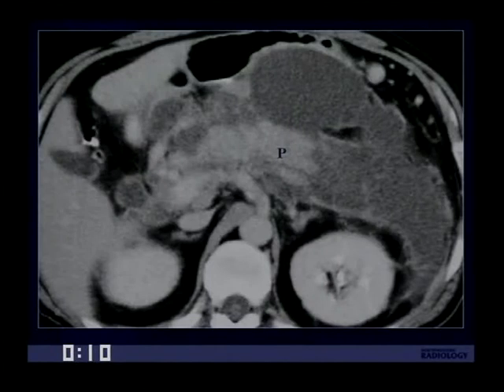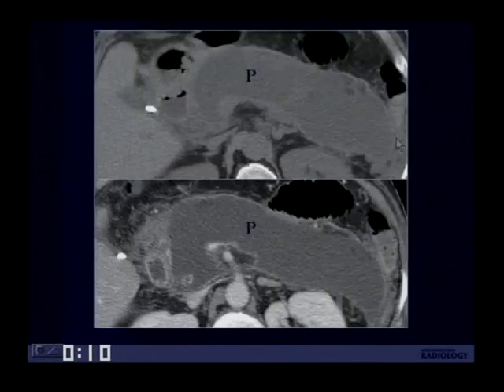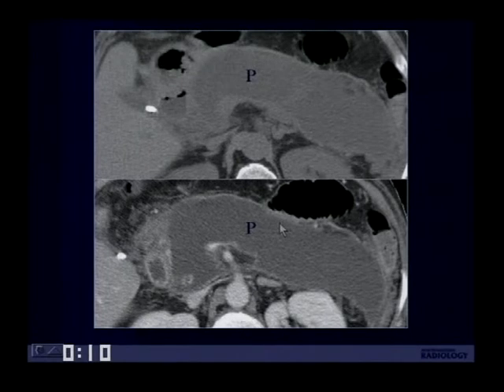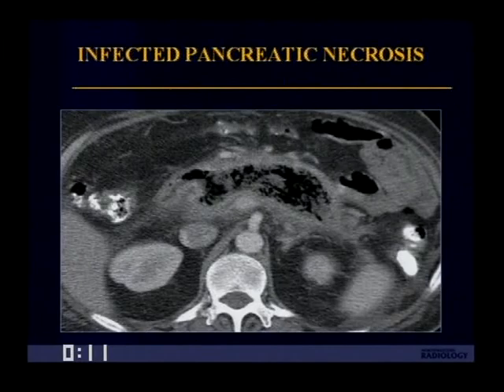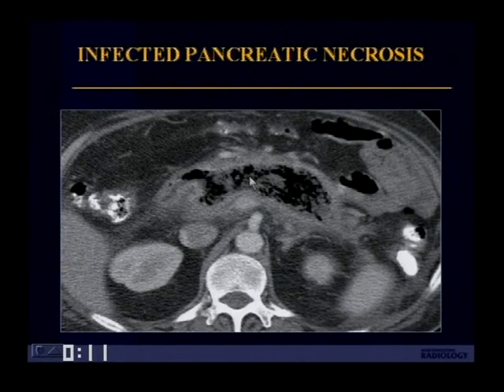Here's an example showing normal-enhancing pancreas up to the pancreatic tail where there's a large pancreatic fluid collection and necrosis. Another patient on unenhanced CT shows a large fluid collection with no normal-appearing pancreatic tissue, and after contrast administration there is no enhancing pancreatic tissue — this is total necrosis of the pancreas, requiring surgical debridement; the patient subsequently died. This patient with infected pancreatic necrosis has air within the pancreas — when you see air with necrosis, you must suspect infection, which is a poor prognostic indicator and generally requires surgery to debride the pancreas.